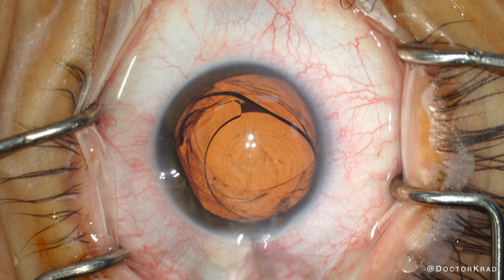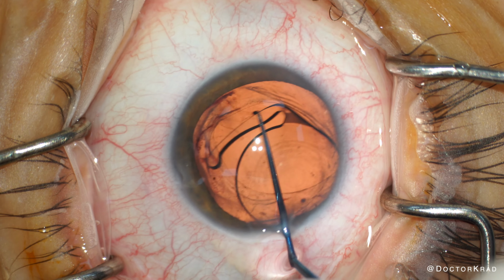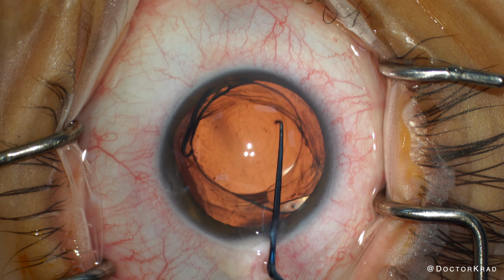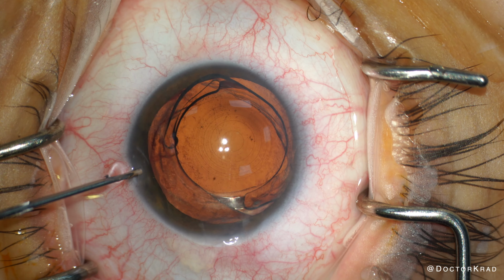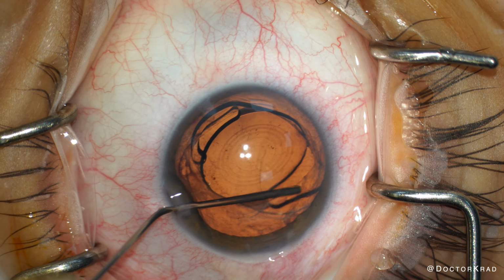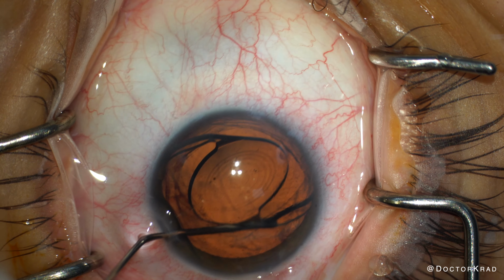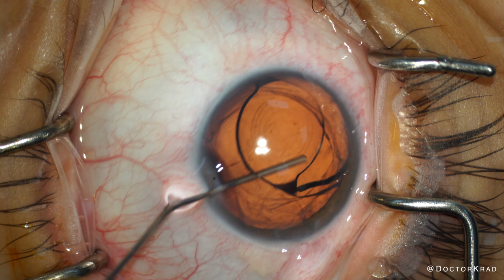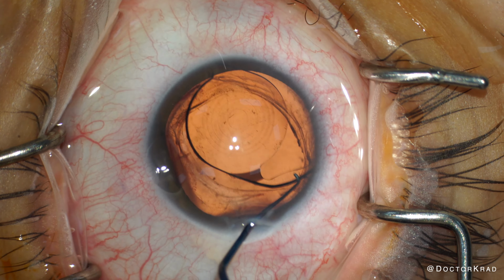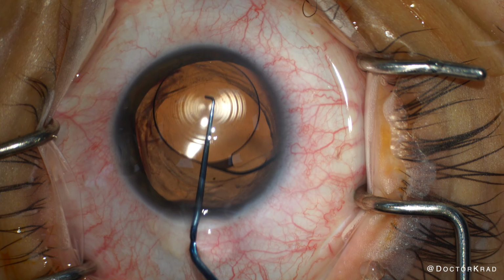Here I'm going behind the haptic and optic, injecting viscoelastic, and I'm going to try to free the bulb of the haptic with viscoelastic. I use a Sinsky to try to free the haptic, and this one comes out pretty easily. I find that when the capsule is adherent, it helps to glide the Sinsky along the haptic. Now I'm shifting my attention to the other haptic bulb, and so I'm being generous with the viscoelastic and injecting posterior and anterior to the bulb. And then again, I'll use my Sinsky to see if it's freed up. And this one also comes out fairly easily.